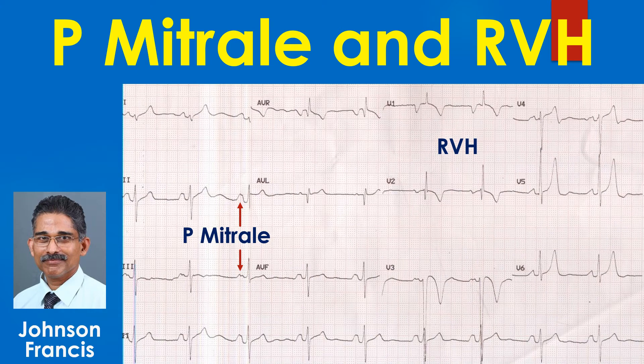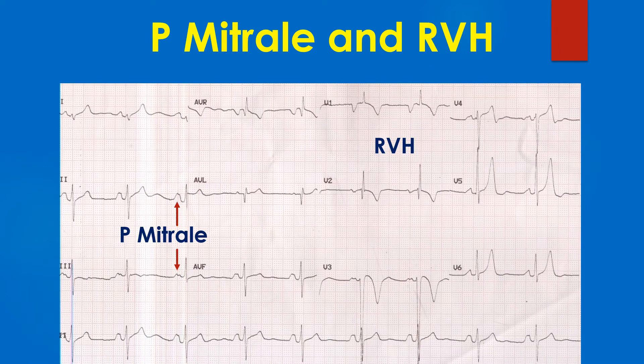This ECG shows P mitral and right ventricular hypertrophy. P mitral, or left atrial enlargement, is manifest as broad notched P waves in lead 2, classically seen in mitral stenosis. The broad negative P wave in V1 is also indicative of left atrial overload.